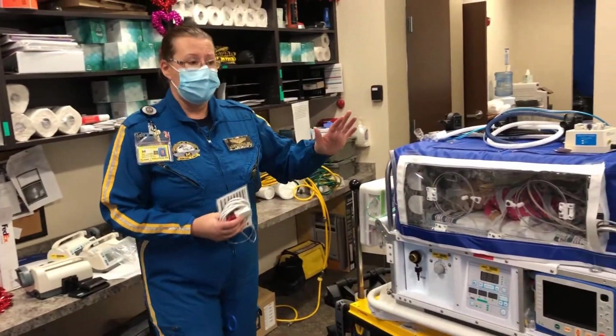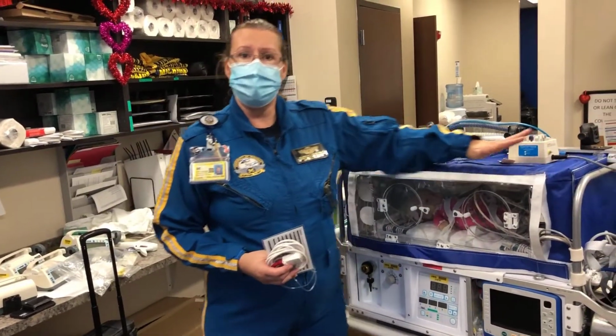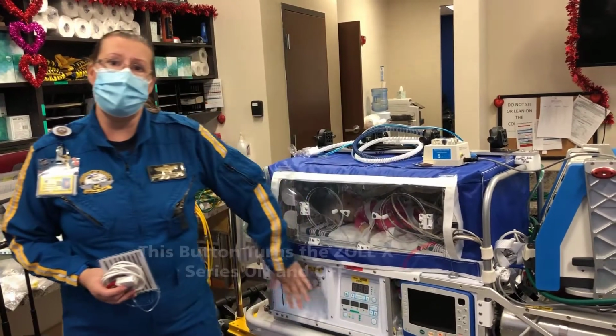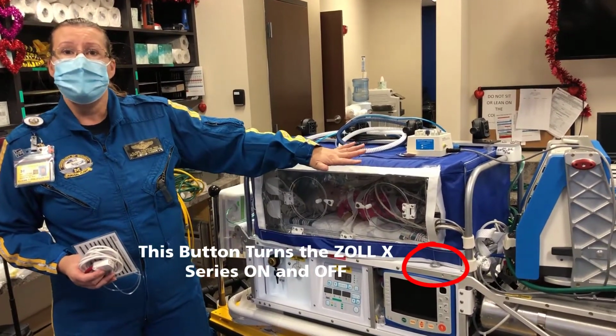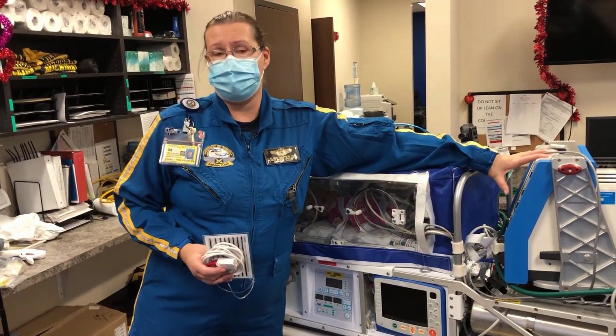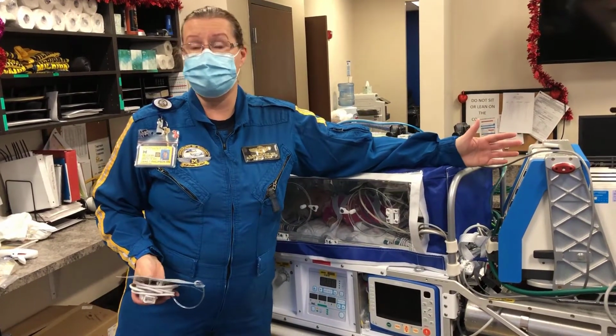Remember that the jet ventilator in this configuration can only deliver 100% oxygen. There is no blending capabilities. So whatever system we're using is going to be 100% through the jet, which is probably what is necessary given this patient population.